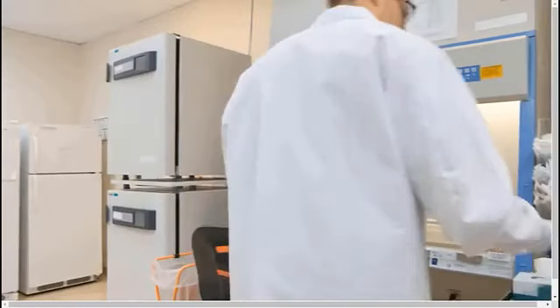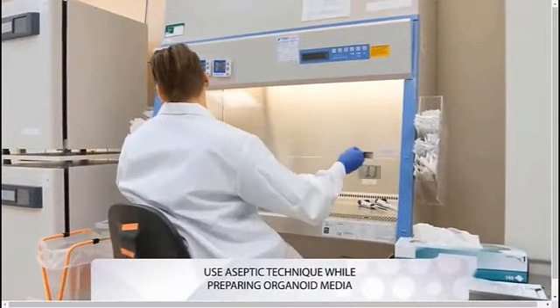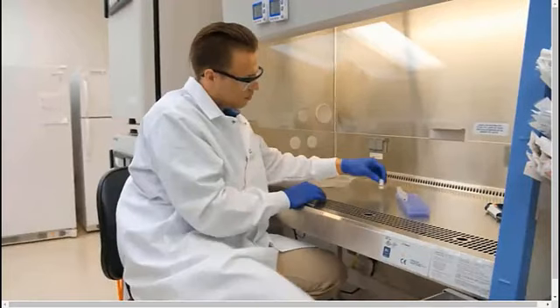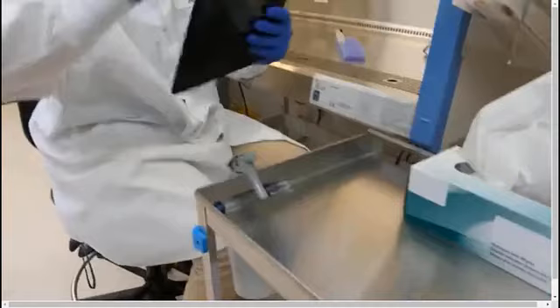Remove the kit from storage and transfer it to a biosafety cabinet. Refer to the specific media formulation instructions for any additional reagents you may need and the precise volumes necessary.